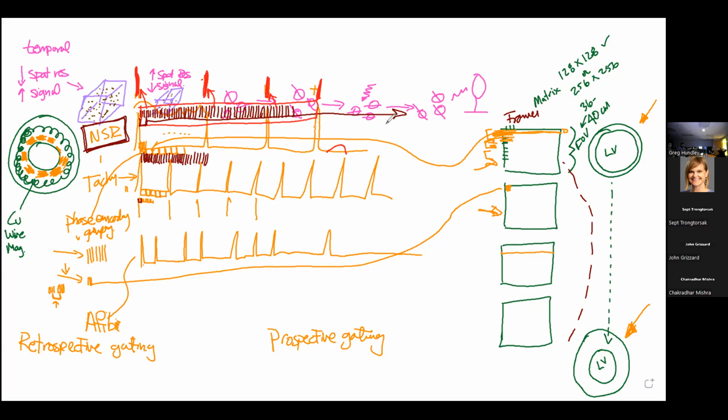Well, now we've got this situation. Now we can have great triggering, right? So we see the QRS complexes, but we've got a new problem, right? So when the scanner goes back to reorganize, it's like, wait a minute, I've got this many of these guys here, and I've got this many of these guys here. What do I do? And you get a smudged image.